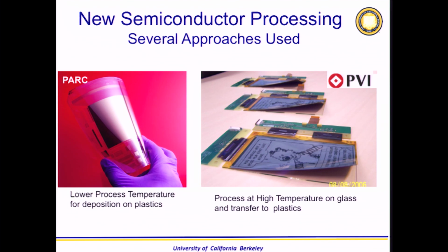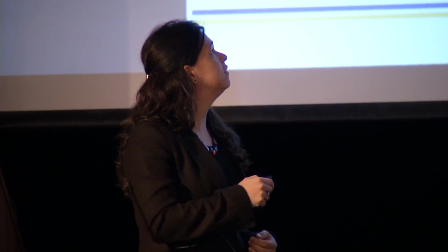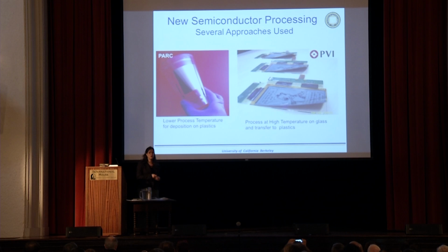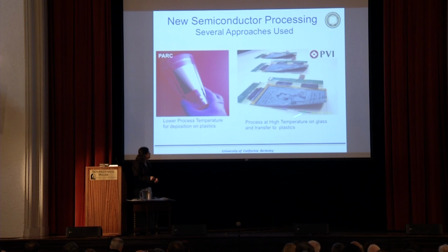And then you change the process temperature. The ovens in the fabrication lab are operating at way lower temperatures than what is conventional. So now these devices are fabricated in plastic at only 150 degrees, and we all know that this is very low for semiconducting processing. Others stick to the high temperature, but they process on glass.